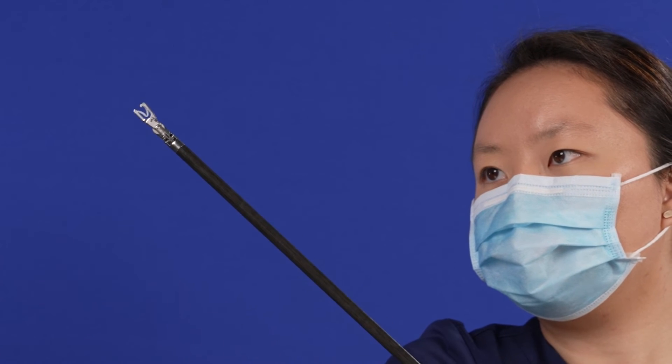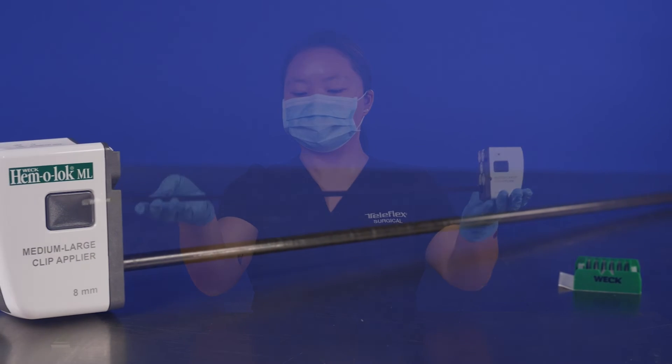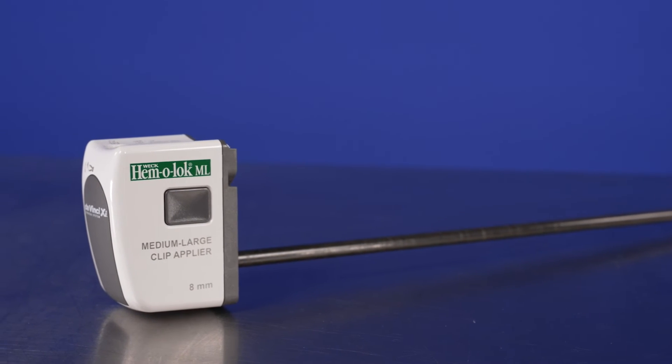Avoid touching or squeezing the jaws, which may cause the clip to compress or fall out of the instrument. Trusted by surgeons for over 50 years, WEC ligation systems help you ligate with security and confidence.